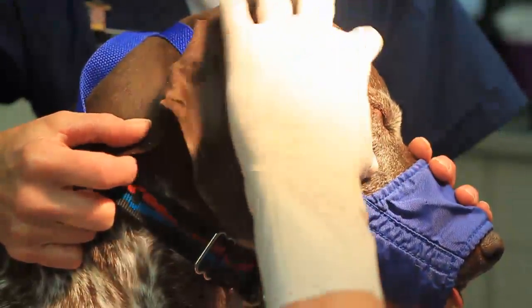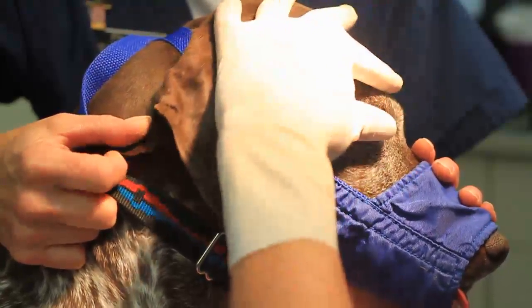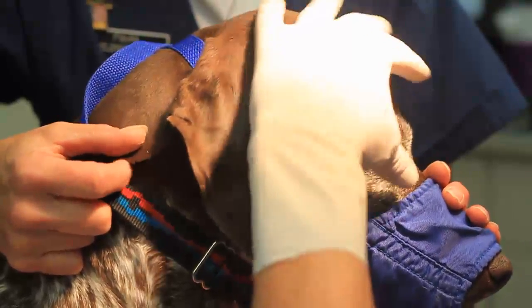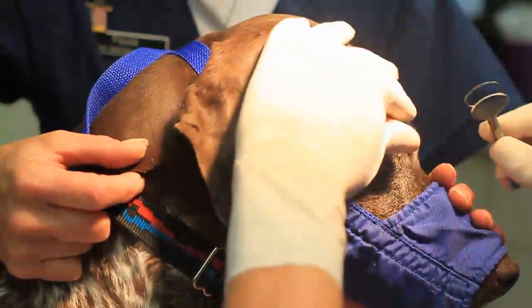This pup was given morphine at half dose at 0.25 mg per kg — just enough to take the edge off. This dog also has a history of epilepsy, so we want to avoid things like acepromazine and some of the drugs that could bring that on. So we're going to do this just with half dose of morphine and a local.